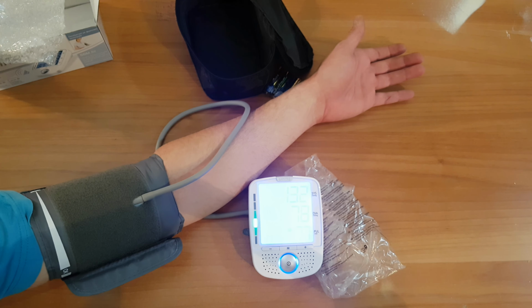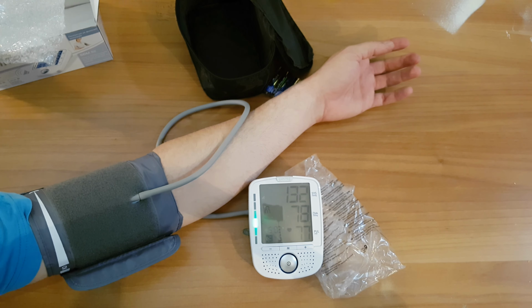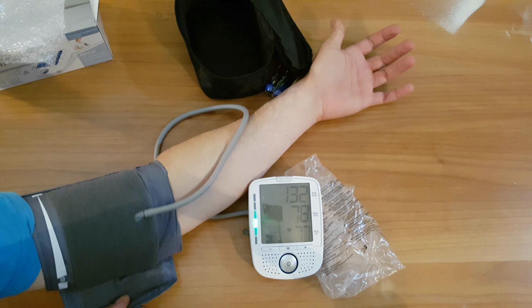Systolic pressure 132 millimeters of mercury. Diastolic pressure 78 millimeters of mercury. Heart rate 77 beats per minute. According to the WHO guidelines, your blood pressure is high to normal. Okay, high to normal. That is because I had lunch 15 minutes before, and that is the reason.